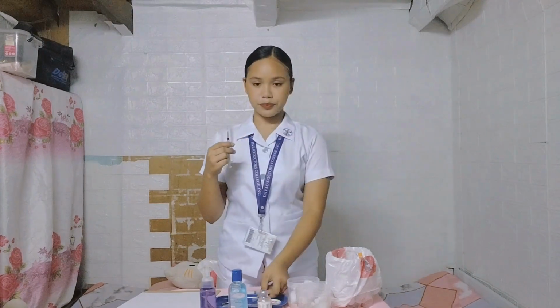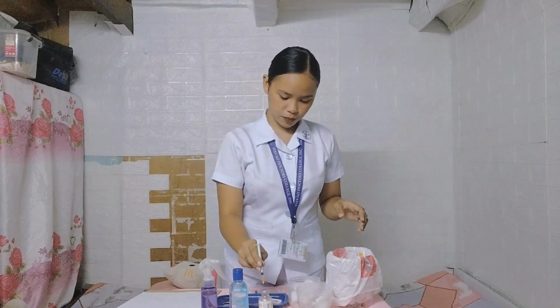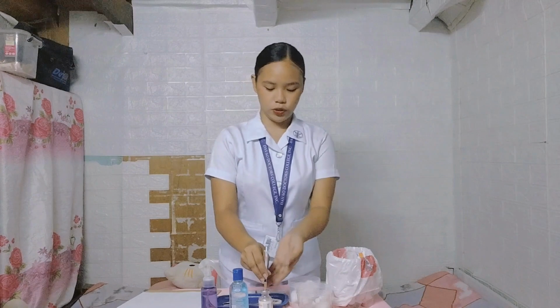Now remove the cap from the needle, and draw up into the syringe an amount of air equal to the volume of the medication to be withdrawn. Now inject the air into the vial, keeping the needle above the surface of the medication.